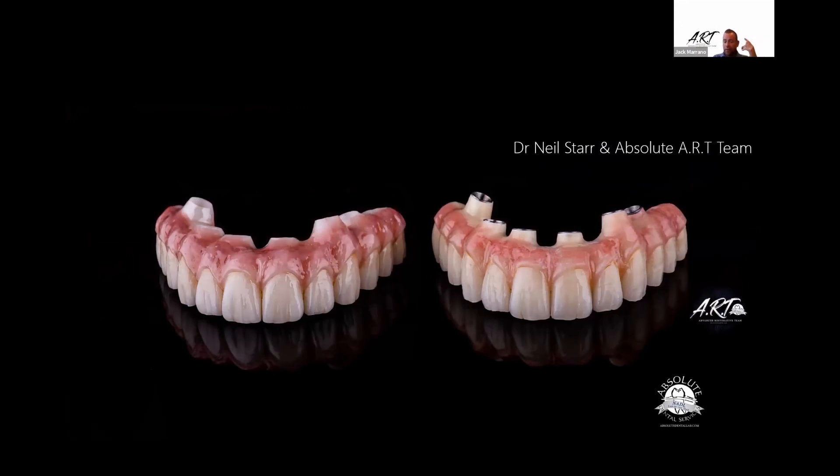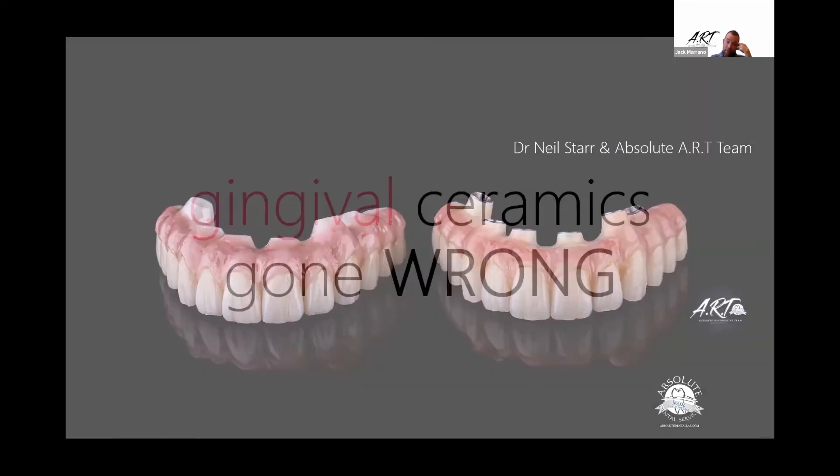Here's another copy mill — Dr. Neil Starr. The PMMA is on the right because you can cheat that far-back MUA and thin it out, but in the zirconia of course you can't. He went ahead and adjusted the tissue for delivery to get more material around it.